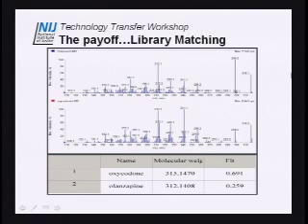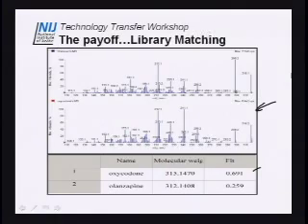And this is the library match of oxycodone that was taken probably 2 years earlier. Looks basically the same. And yesterday I was talking about how the library didn't translate very well, and all you see is the big ions. You can see when we're looking at it that it actually has lots of detail in there. And you can see this fit number here. I don't even care what that number is. What I care is, do I think that's oxycodone? Yes, I do. I've qualitatively matched it from the product ion spectra.